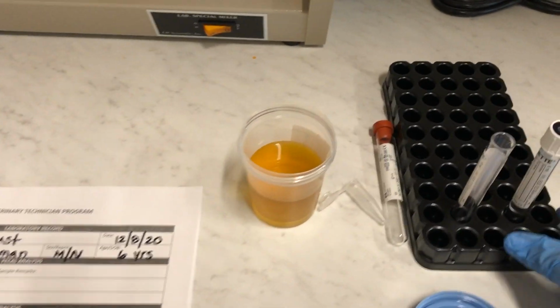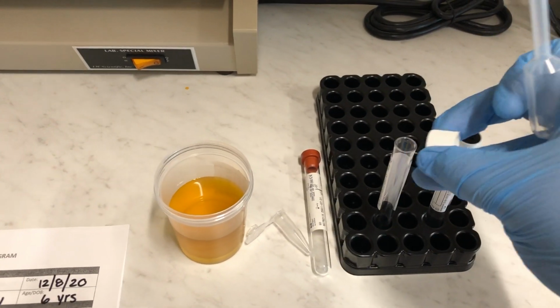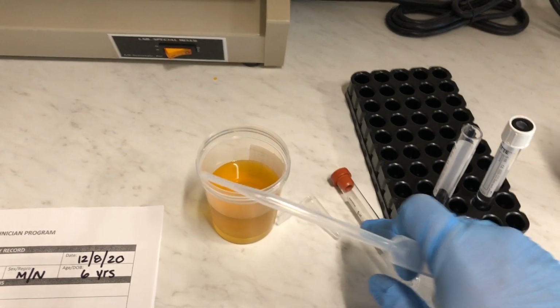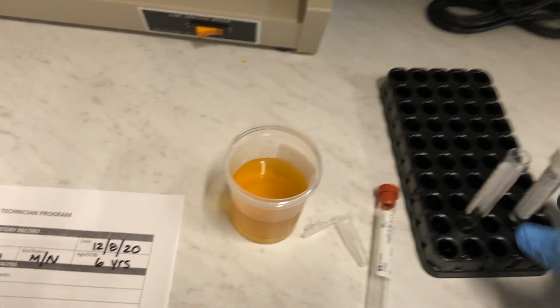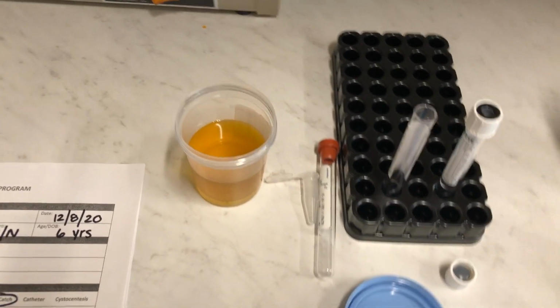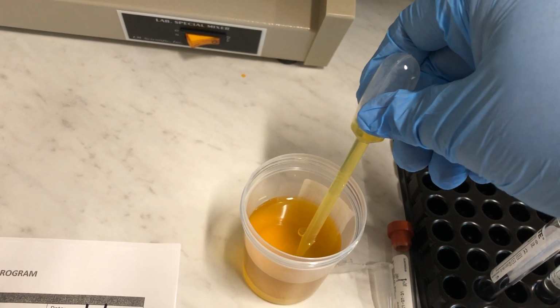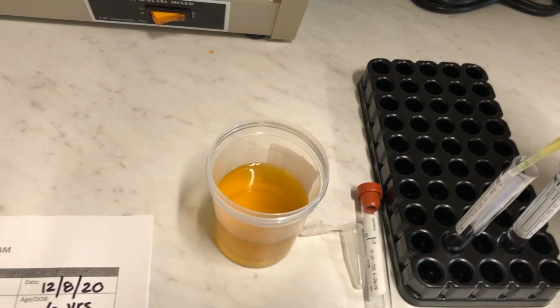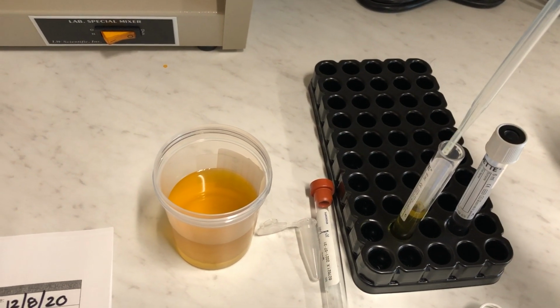So for urine, you can use a couple different tubes. They have to be sterile, non-additive tubes. This is a white top tube that I'm going to be using. You could also use a glass, no additive red top tube, or just a plain plastic tube of any kind with no substance or chemicals in it. But I'm going to use the white top tube. So I need to collect a sample to fill this tube with. The more I can fill the tube with, the better, because that'll give me more sediment.